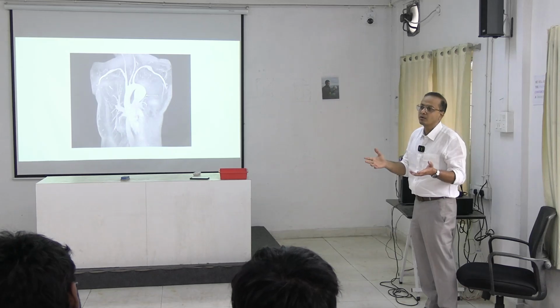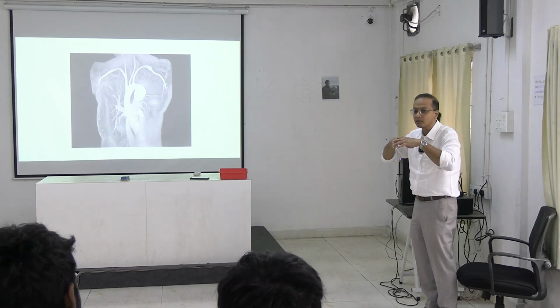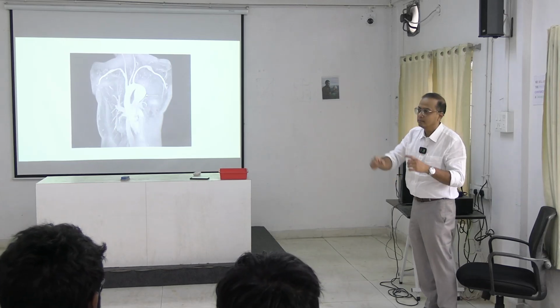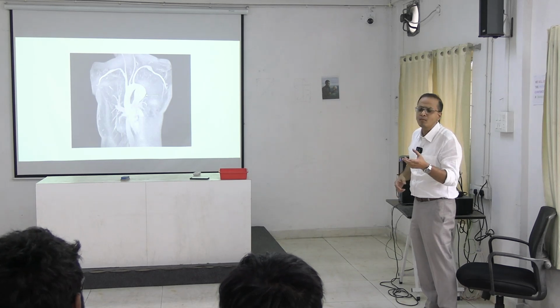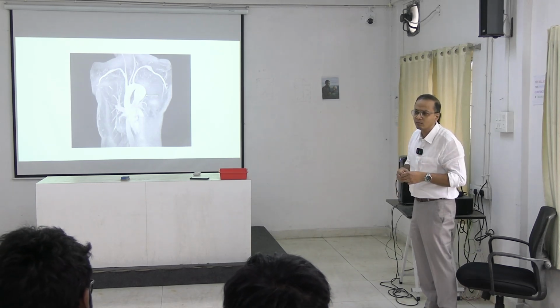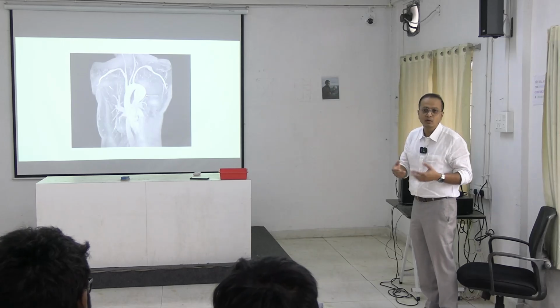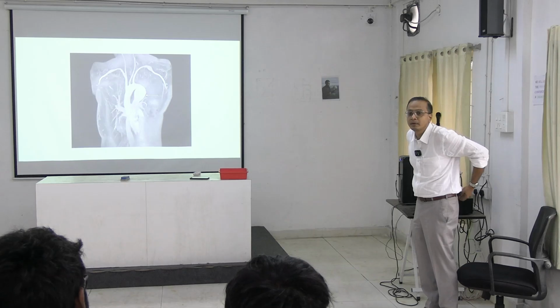X-ray is just arteriogram, bronchogram. If it is a CT scan, you are going to get a clearer picture. The more pixels you add, the better pictures you get. How many megapixels is the camera in your phone? 30 MP, 40 MP, 60 MP, likewise you get clearer pictures, updated versions of it, right? So this is the technology we are seeing.